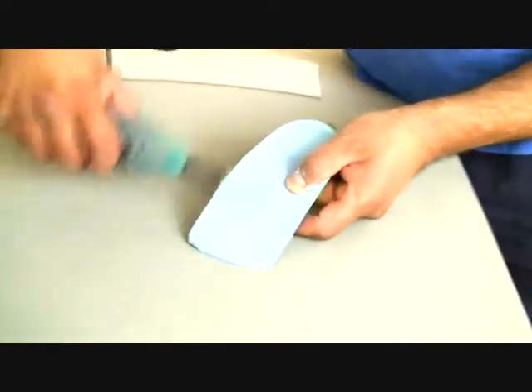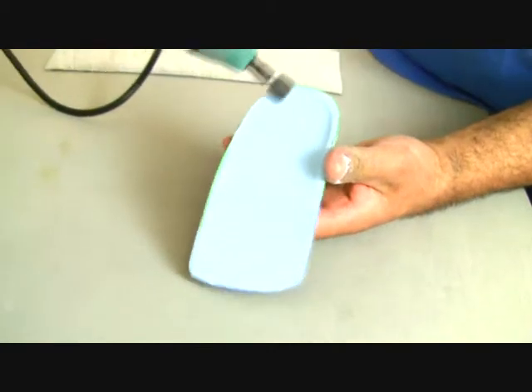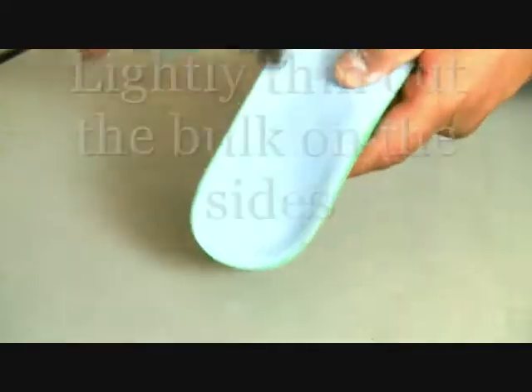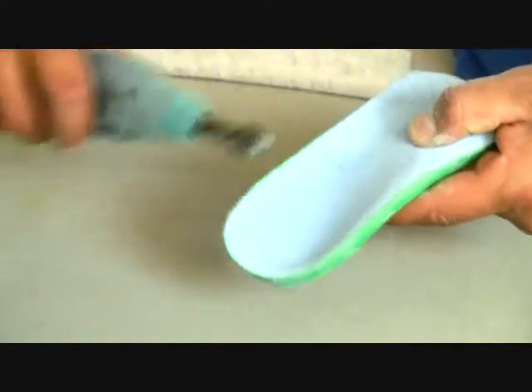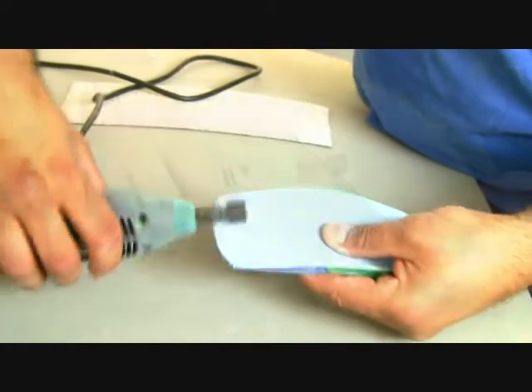Use the Dremel to thin the PPT down around the edges. Use the hand grinder or Dremel to thin the bulk around the edges, and pay particular attention to tapering the distal edge of the orthotic so that it's comfortable for the patient.